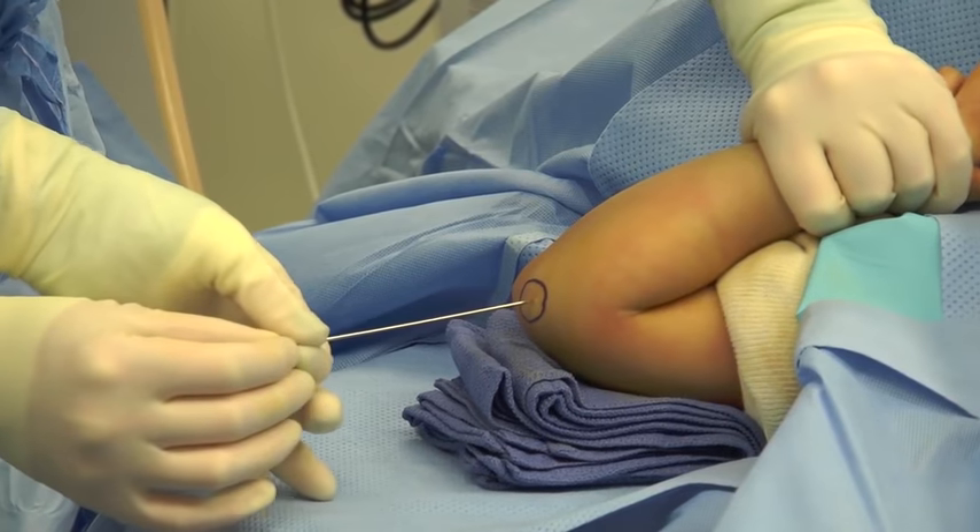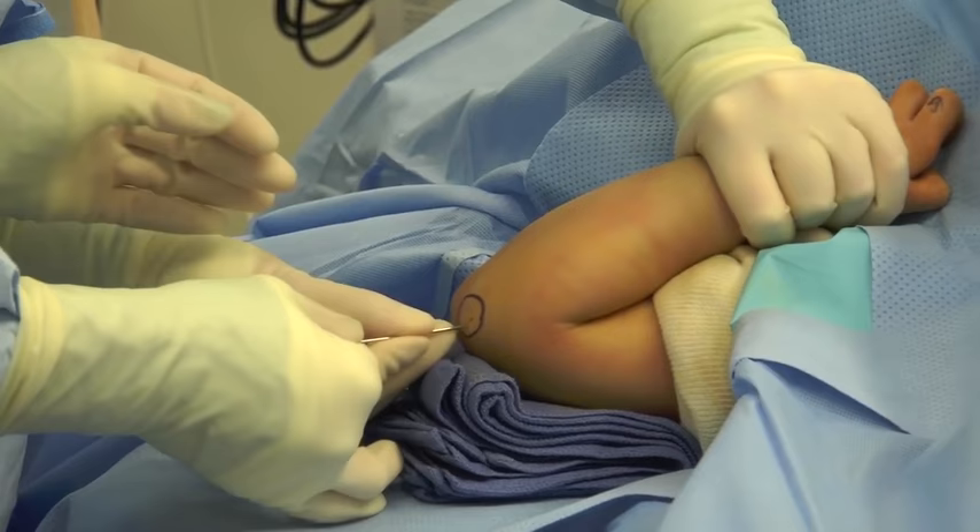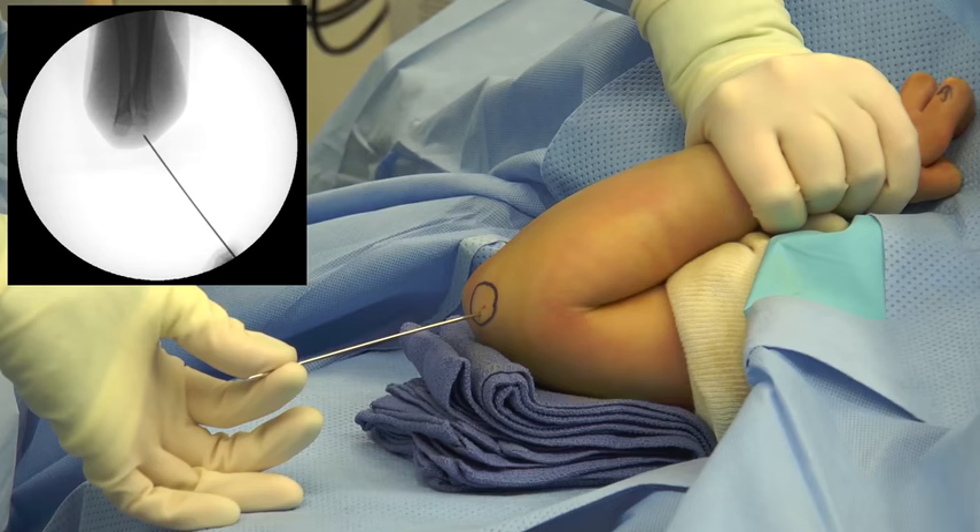The arm is placed up on towels and a target is drawn out over the capitellum. Once fluoroscopy has been used to mark out the trajectory of the pins, they are placed through the skin, aiming to get maximum divergence at the fracture site.